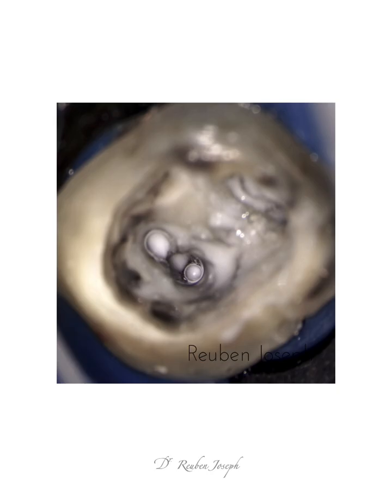The first thing you can do is, if at all, for that particular case, I intend giving an interim dressing of calcium hydroxide before a subsequent visit, I would plan and take my picture at that point, because light from the microscope, when it falls on the calcium hydroxide, which is white, is going to get thrown back and there's going to be more light and clarity inside the root canal space. This is one thing you can do.